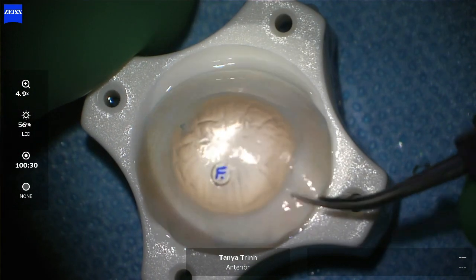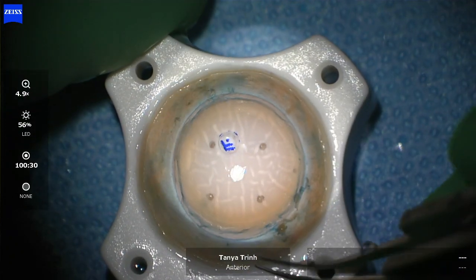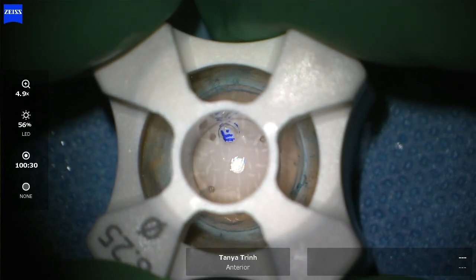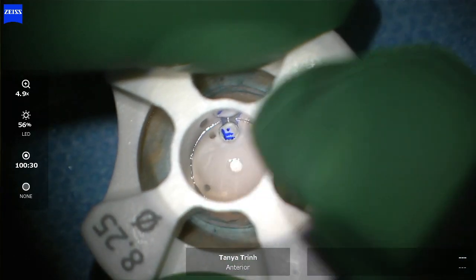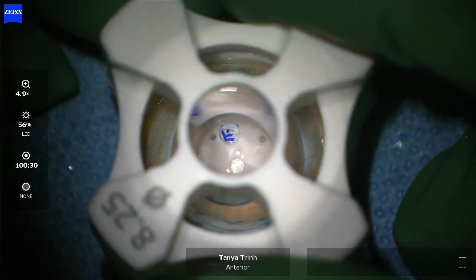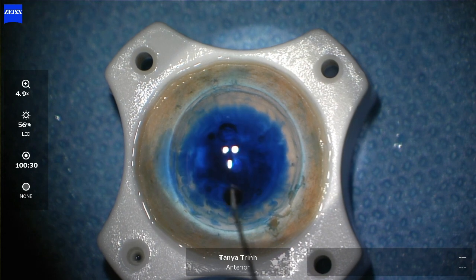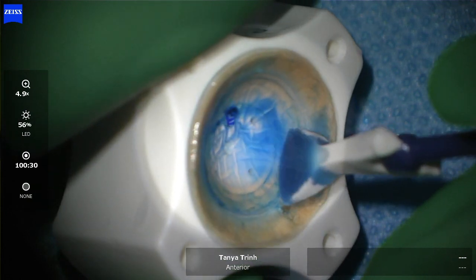You can assess the tissue for dryness by looking at the reflex if you want. I'm now orientating the tissue where the F sign is between two of those smaller holes again, so that when my trephine comes down it's included and I get a complete cut. I'm tapping fairly firmly here — depending on the variety of trephine, you really want to make sure you have a fairly complete cut through Descemet's but not through the stroma, although if you do get a complete cut through the stroma it's not a big issue. Here I'm gently adding a few drops of Vision Blue because I want to see the edge of the trephination step.